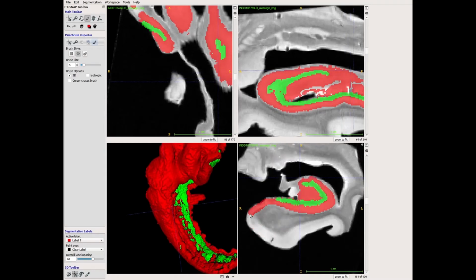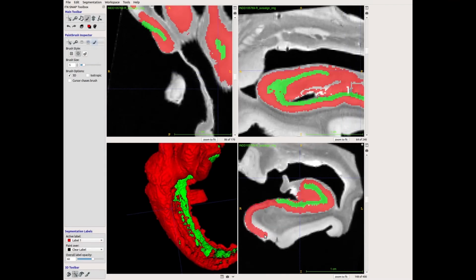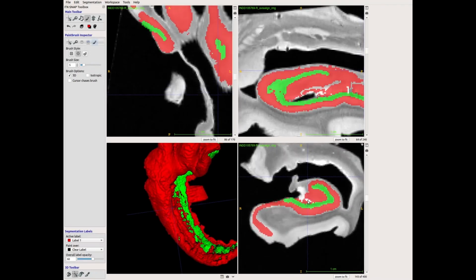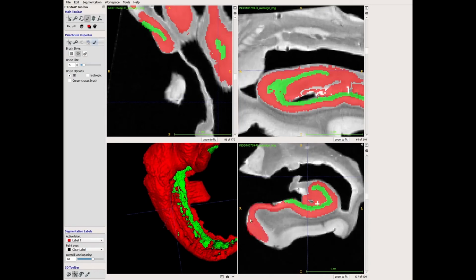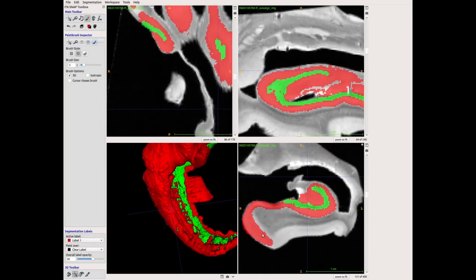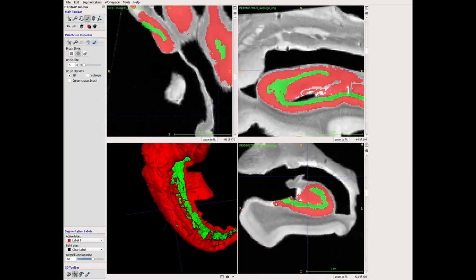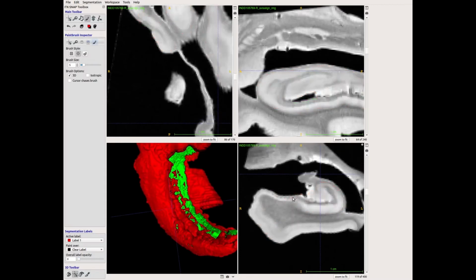And of course, when I did that dilation, I didn't get all of the gray matter that I would like to. In particular, you can see on the medial side, so this would be the subiculum of the hippocampus, there is no SRLM label, so I'm just filling in additional gray matter label all the way to where it meets the neocortex. So you can see where that tissue thickens out quite a bit. That would be the entorhinal cortex, or more posteriorly here, the parahippocampal cortex.